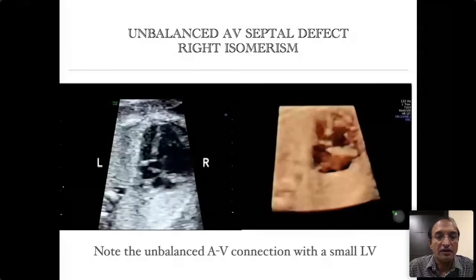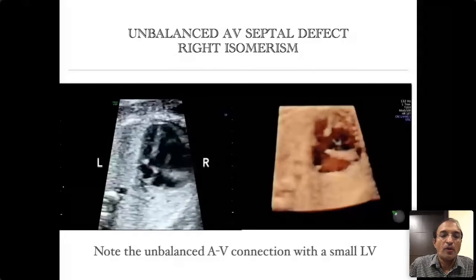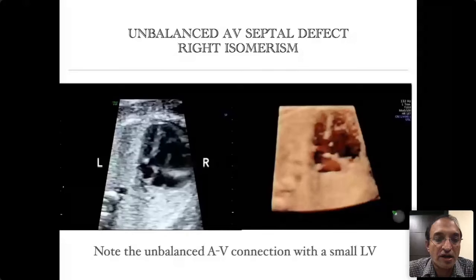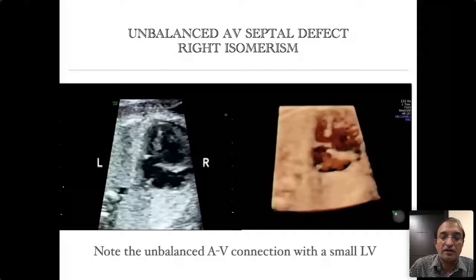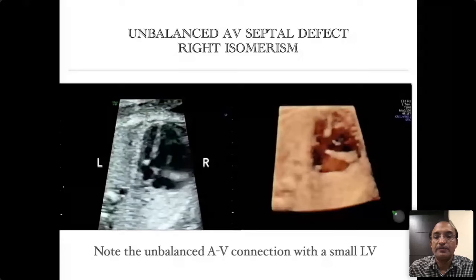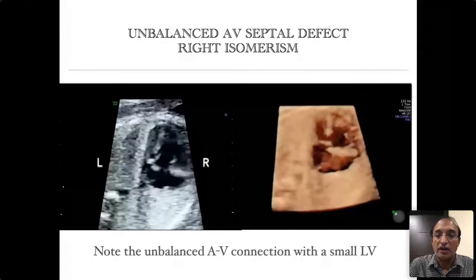In an anatomical sense you are seeing a small LV, but that is not the correct diagnosis. Please do not label this condition as hypoplastic left heart syndrome. I have seen several reports where an unbalanced AVSD is reported as hypoplastic left heart syndrome — that is wrong terminology. The correct terminology is unbalanced type of AV septal defect with small LV, which is often part of an entity called right isomerism.